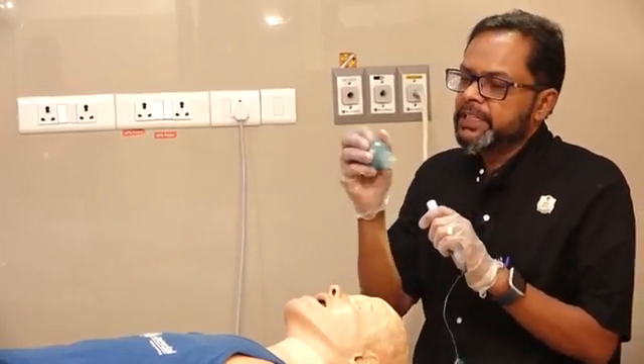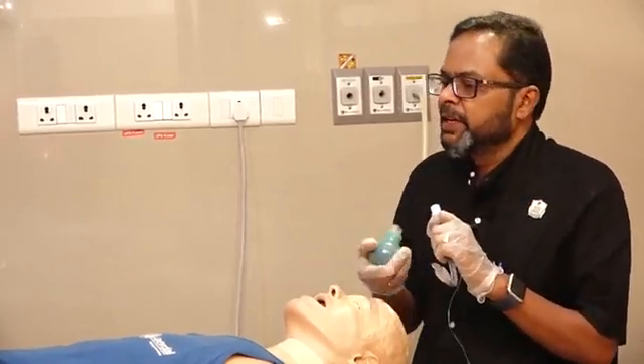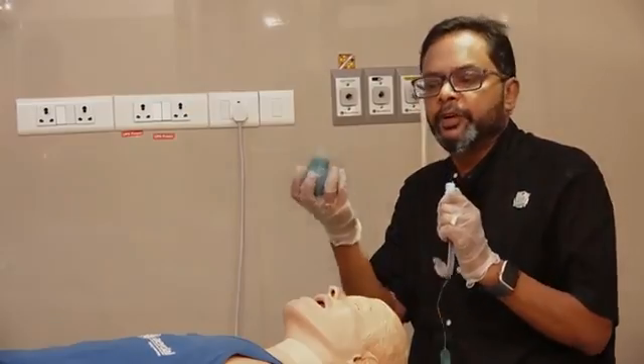So this is the basic principle behind the EDD. It is a very useful device when you need to rule out an esophageal intubation.